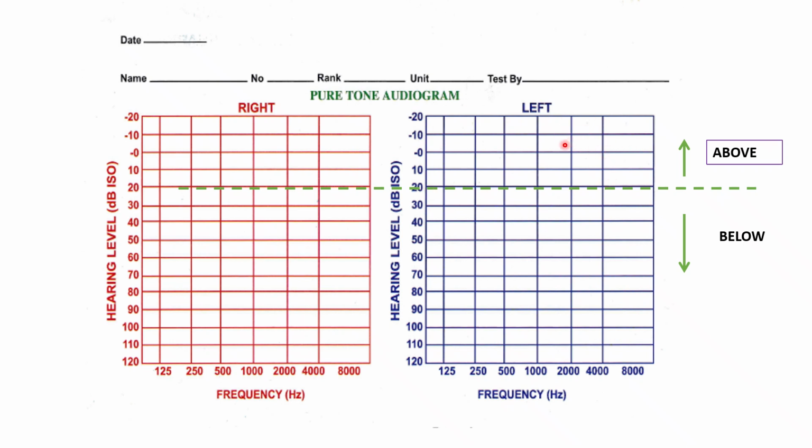Whereas when we see it, it is not above 10, 0, it is coming under the 20. But when we are describing the audiogram, this upper part becomes above. So don't be confused by that. Above 20 is the normal, and below 20, 30, 40, 50, 60, this will be the diseased part.